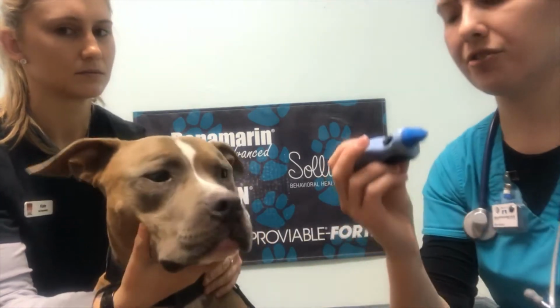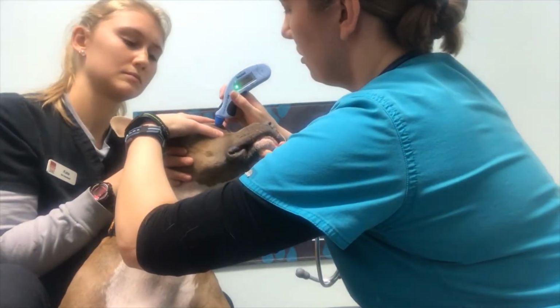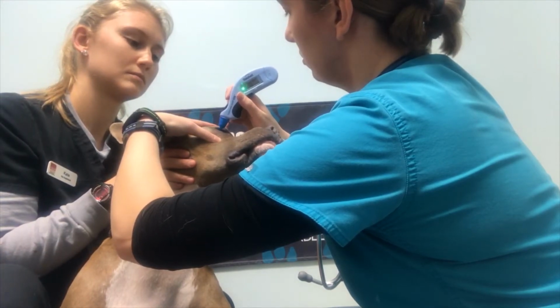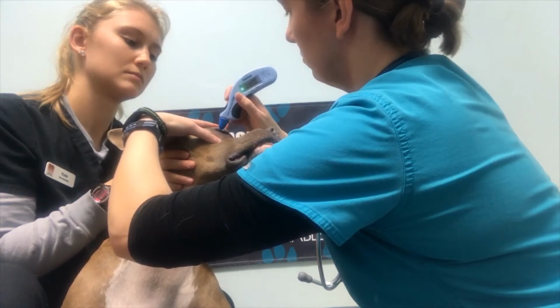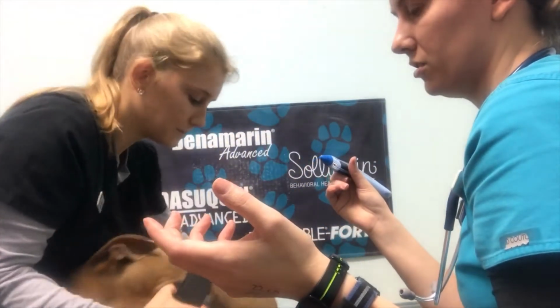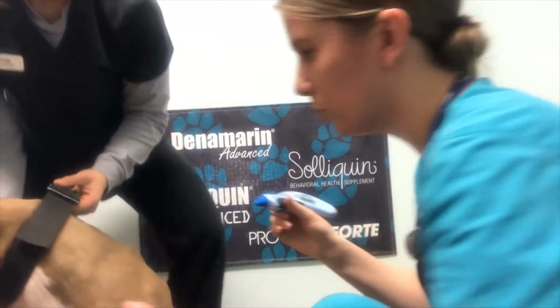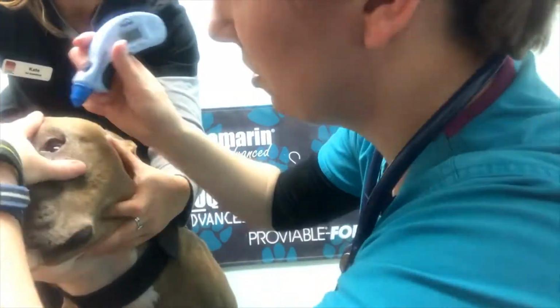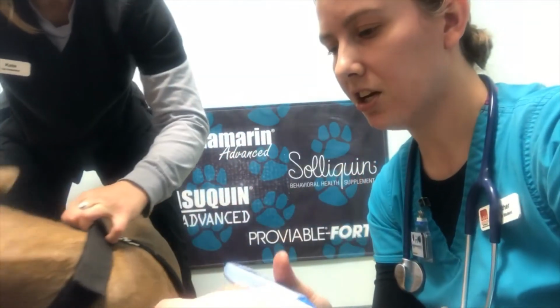So I'm going to take an average of 3 readings on each eye. So it was like 9, 10, and 13. So that would be an average of about 11 or 12 or so, which is on the lower end of the normal range, but is still normal. So now we'll move on to his left eye, and I'll do the same process. A 20, a 13, and a 13.